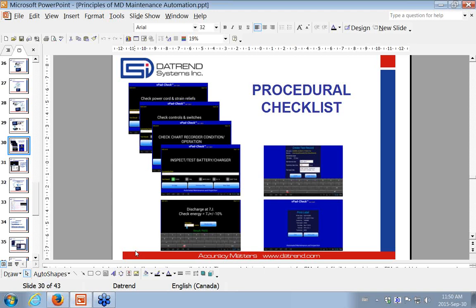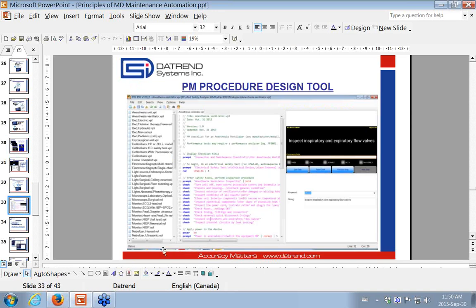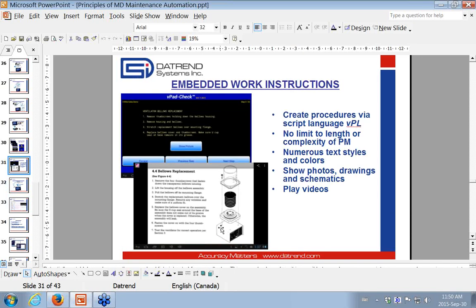And although this can work with a CMMS, this app actually comes with its own PM procedures. The app provides a menu that you can select a PM procedure from, and you can then work through that. Alternatively, you can create your own procedures like this and install these procedures on the tablet, and they will then be usable to you. So you don't necessarily need a CMMS to create procedures. You can use these apps independently on their own.